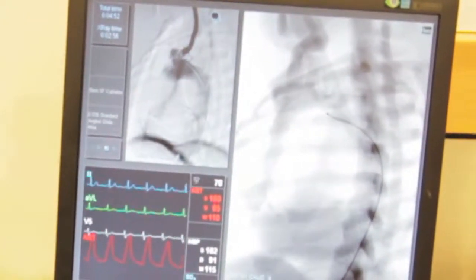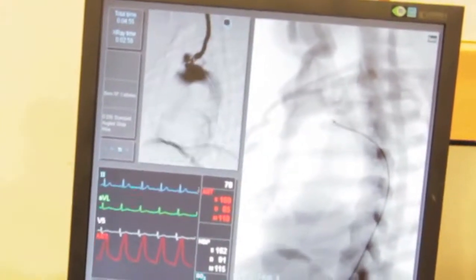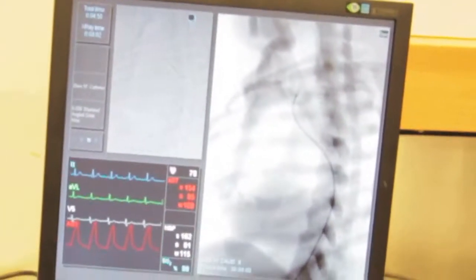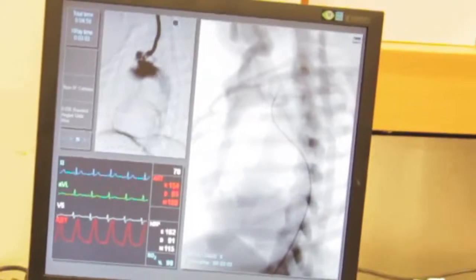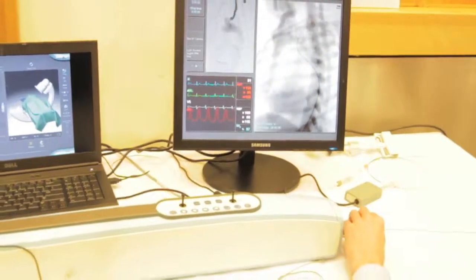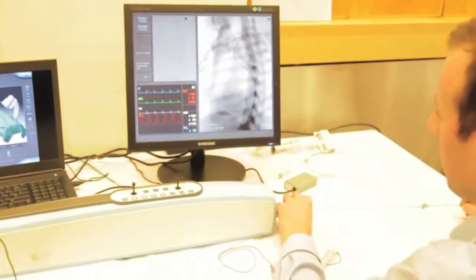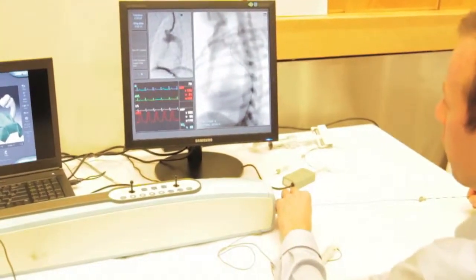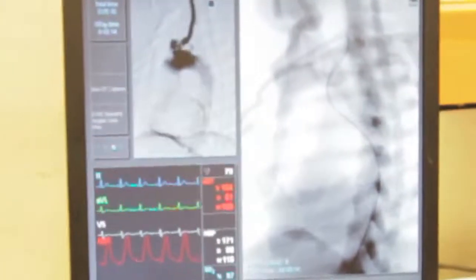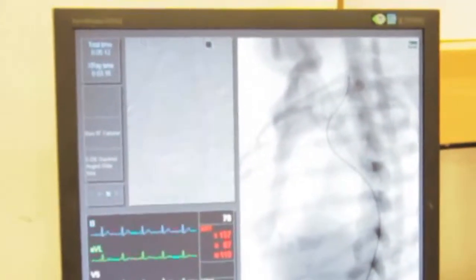As we advance as far as we can, the catheter starts to back out. When we're in a stable position you can see everything jump forward. The guide wire is currently off the top of the screen — we have no idea what it's doing, which is actually a dangerous situation. So we're going to draw it back until we can see the tip on screen, and then continue to advance the catheter safely.